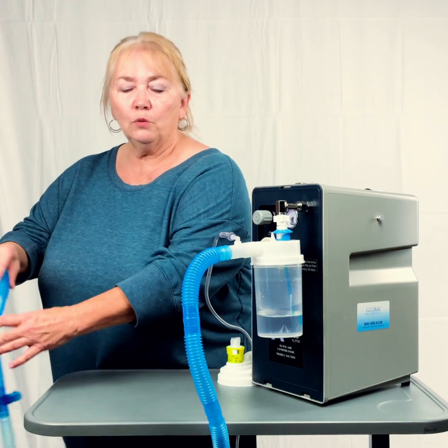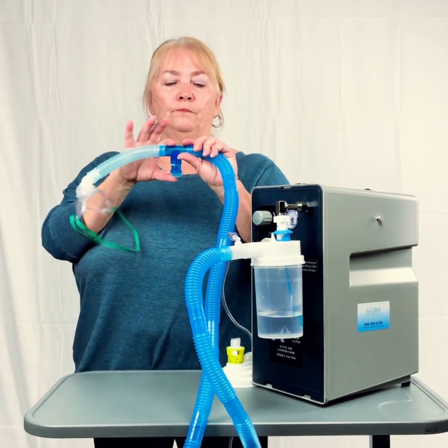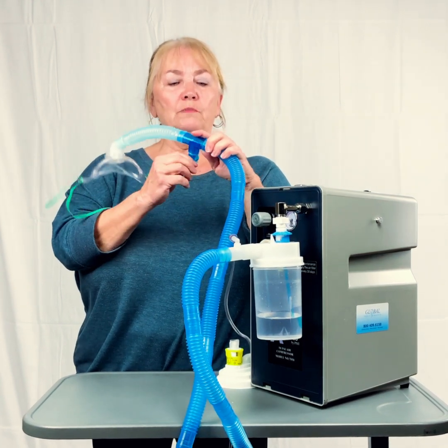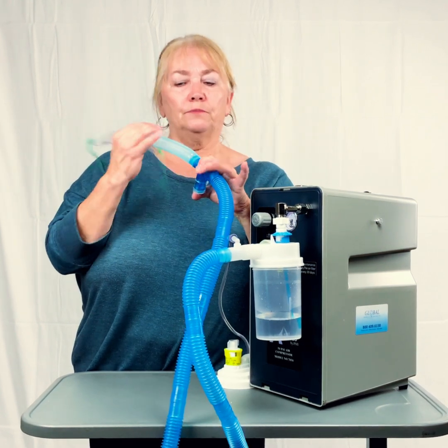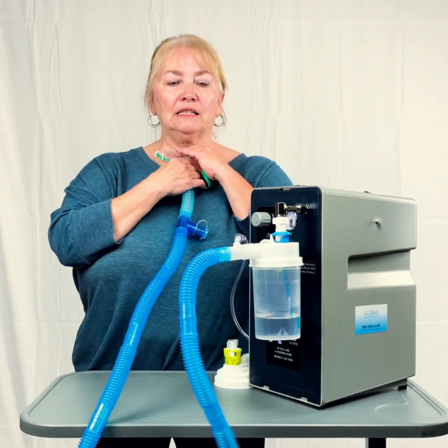The drain bag is for the condensation, that's the rain out that we're having in the tubing. The drain bag should always be at the lowest point. Then we have another piece of tubing. This is our valve T adapter. This is so we can get breathing treatments in line without having to take everything off of them and hooking up to a breathing treatment. Then we have a short piece of tubing and our trach mask.